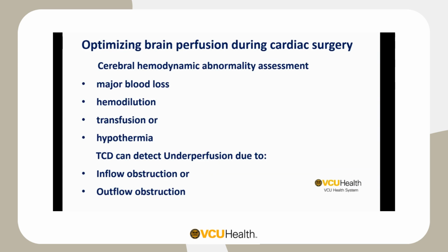If the insonation angle, vessel diameter, and blood viscosity remain nearly constant, change in mean flow velocity reflects similar change in volume flow, shown by Clark et al. in 1996. Since the middle cerebral artery that we insonate through the temporal window typically carries 40% of the hemispheric blood flow, it is the favored site for surgical TCD monitoring.